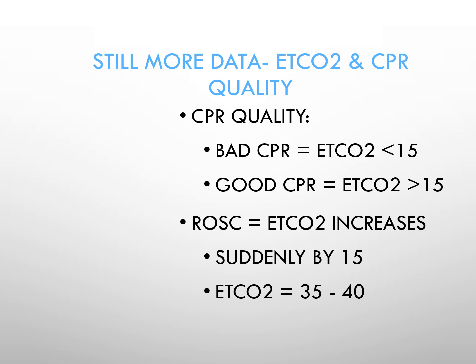In addition, the return of spontaneous cardiac activity can also be indicated when there's a sudden increase in the end-tidal CO2, sometimes as much as 10 or 15 or more within a few seconds, to a level that's in the range of 35 to 40. Again, that would be suggestive that the heart has started to pump effectively for the patient.